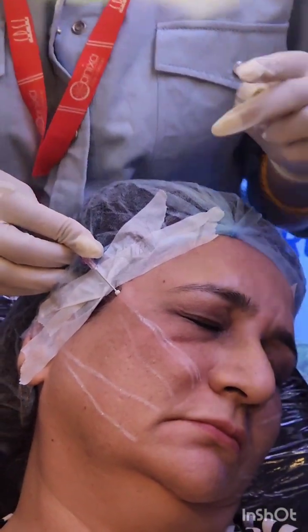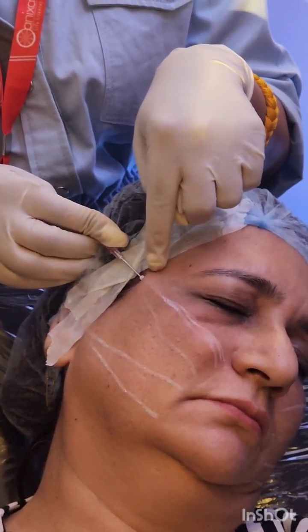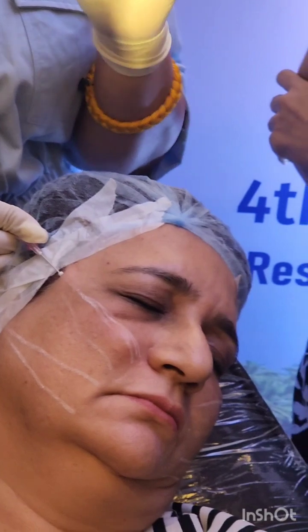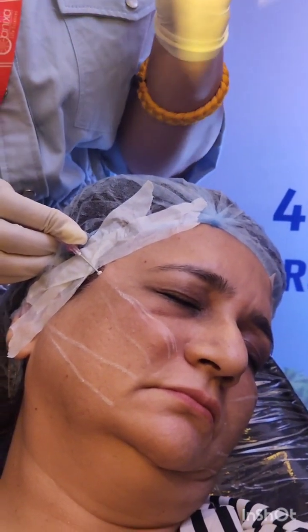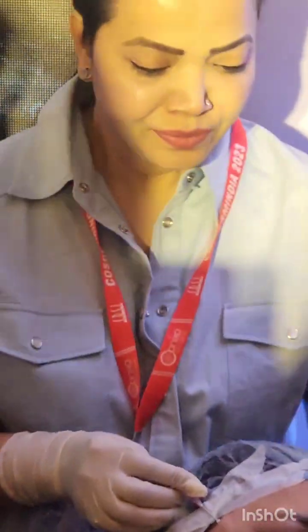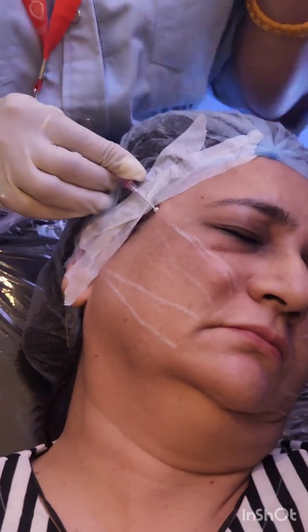We are not maneuvering the ligaments. There is no ligament there. I have anchored here over the ligament. Now I'm going into the subcutaneous tissue. That's why she's not wincing, because there is no nerve innervation. There is no blood vessel in the subcutaneous plane. We all know, right? Now I have reached. You can feel the needle here.